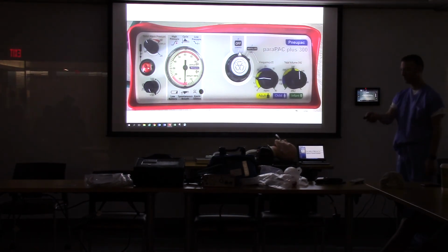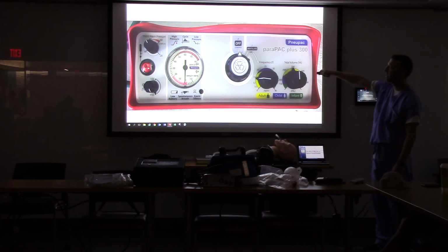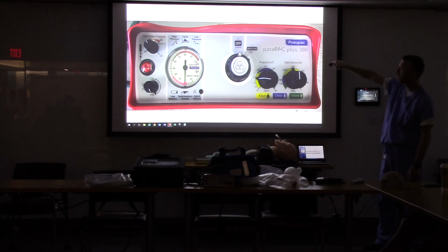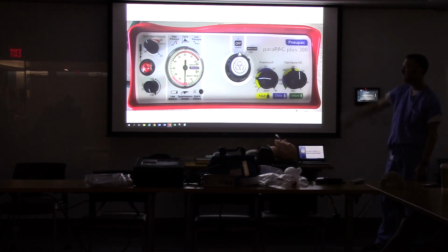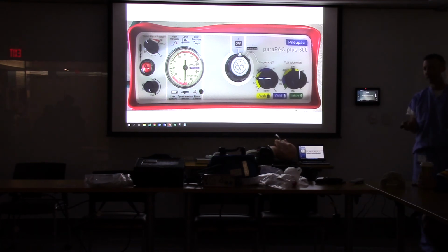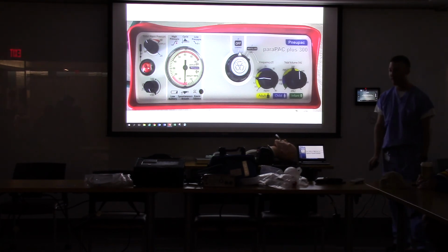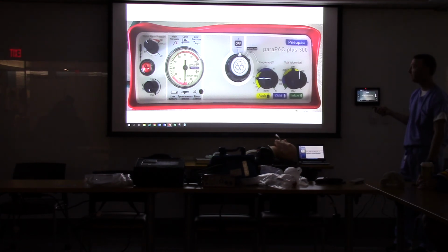So this is our stupid ventilator as opposed to the smart ventilator over here. So up here is our relief pressure alarm. This is what I said, that it generally is set in the 30 to 40 range for non-bronchospastic lungs, but you may need to put a pressure up to 60. If you are at a pressure of 60 and the patient is still not getting breath, you can't use this ventilator. So if you have a really bad asthmatic and this is the vent that you brought to the patient, you can't transport the patient with that ventilator. You either need to go to this ventilator over here, or you need to do it by BVM and hope to God that you don't overventilate them, because this one just doesn't allow for pressures that high.